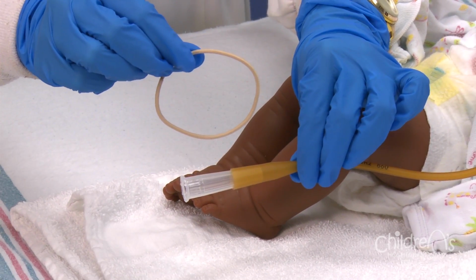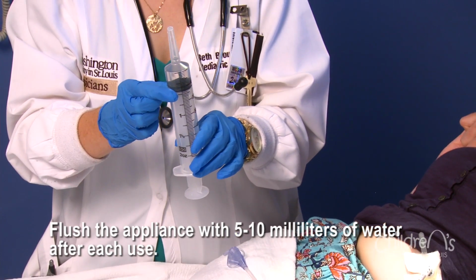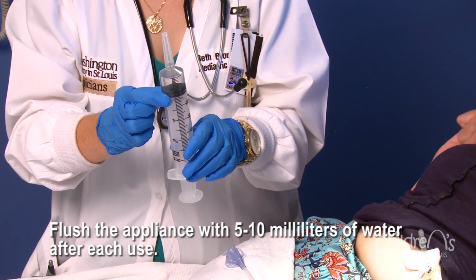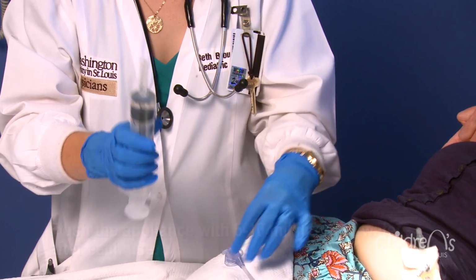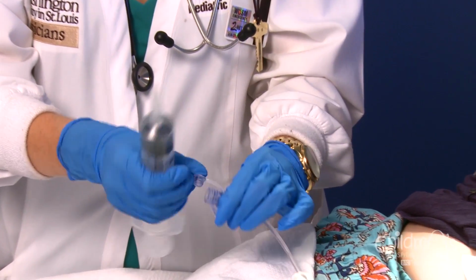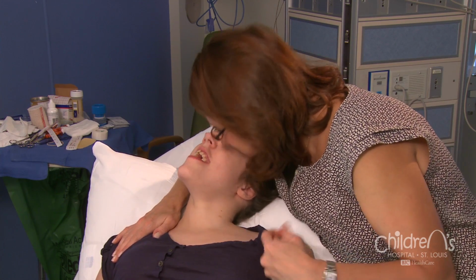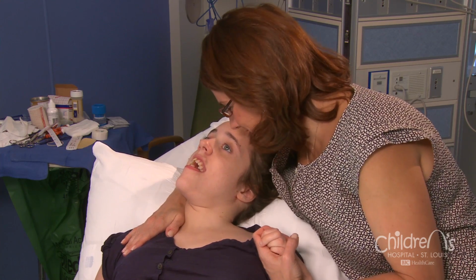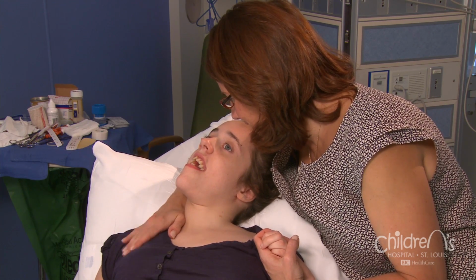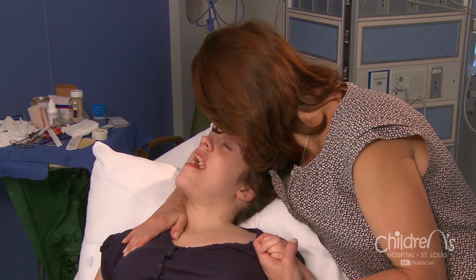Remember, the gastrostomy appliance should be flushed with 5 to 10 milliliters of water after every feeding and with medications. It should also be flushed once a day, even when it is not in use, to prevent clogging. We encourage nurturing your child during feedings. It is an important time to continue to provide your child with pleasant sensations and opportunities for bonding. This may include holding, rocking, and talking to your child during feedings.